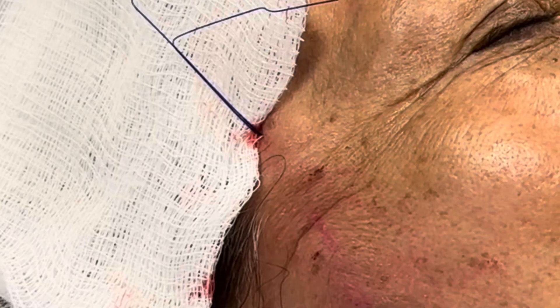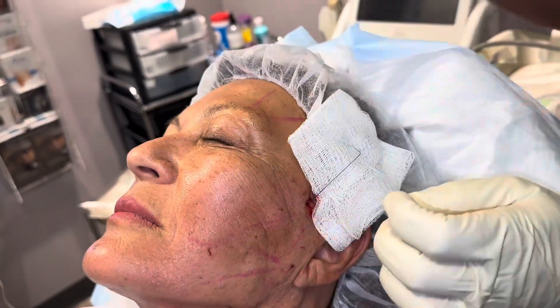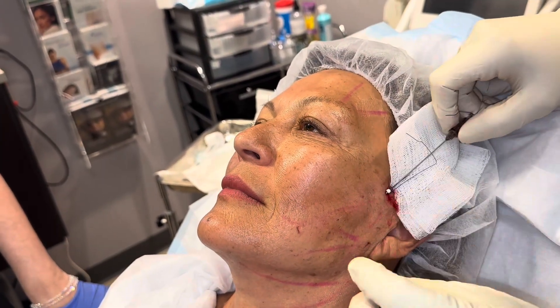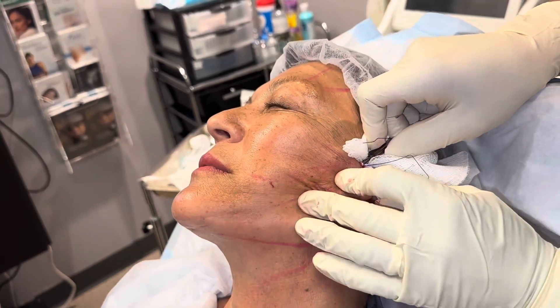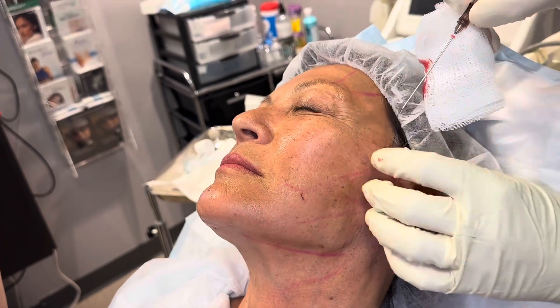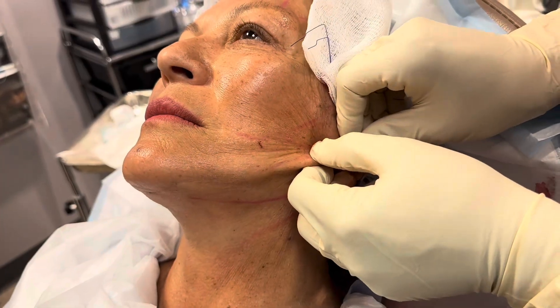See how the threads are sticking out? We're going to pull those after we place the threads. We're going to place the threads on both sides, going in different directions and different vectors. Some of the threads will be pulling up, some of them will be pulling back, and the threads have textured barbs on them so that when you pull, it doesn't come back out.